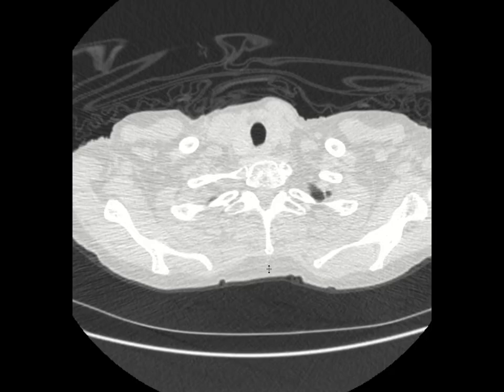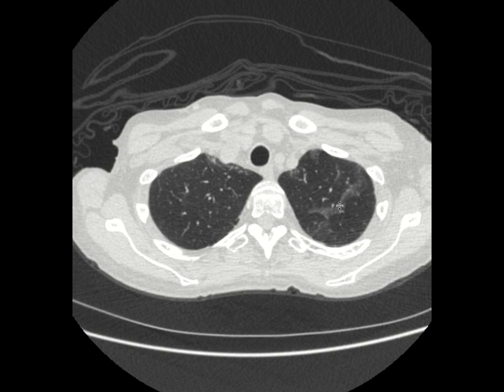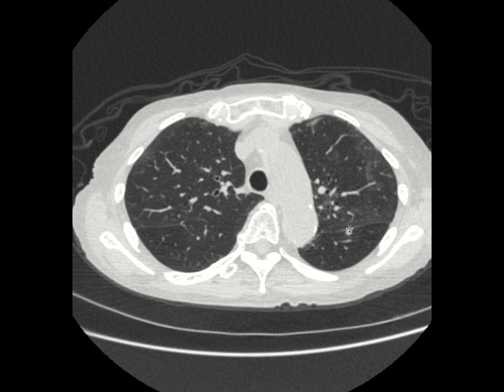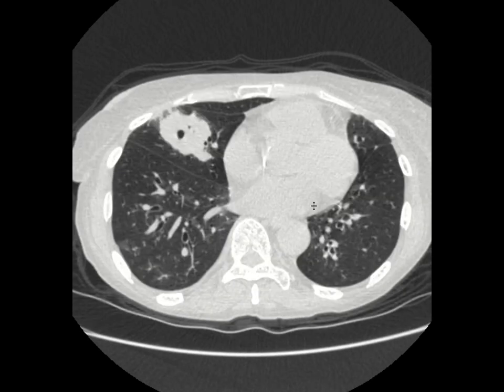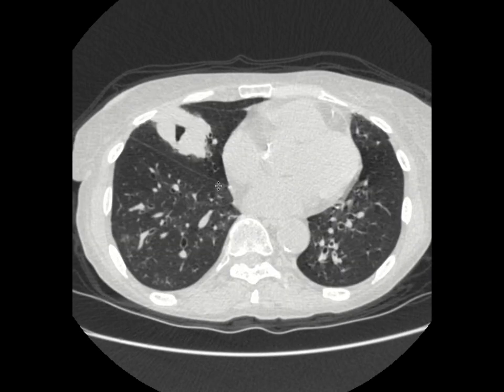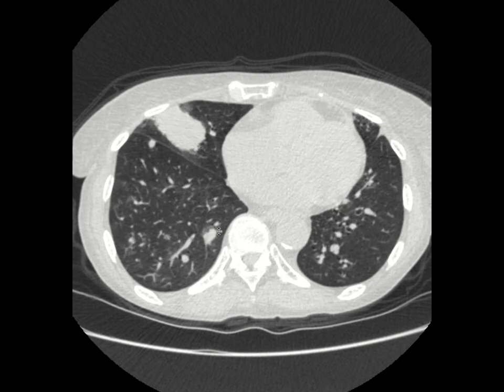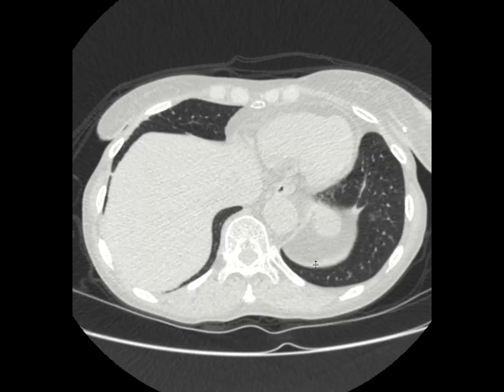Non-contrast axial chest CT was obtained. Axial images reveal ground glass opacities in the left upper lobe. As we scroll down further, we see nodular opacities in the left lower lobe and the region of the lingula. The dominant finding is a cavitary mass in the right middle lobe, which was also seen on the chest X-ray. There are several other nodules in the right lower lobe as well as the left lower lobe.